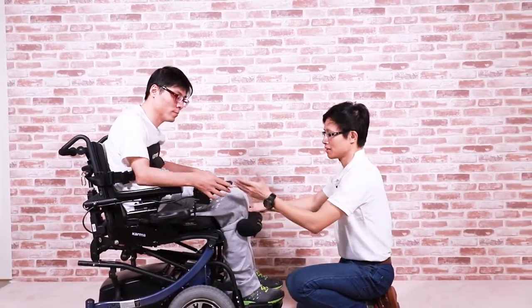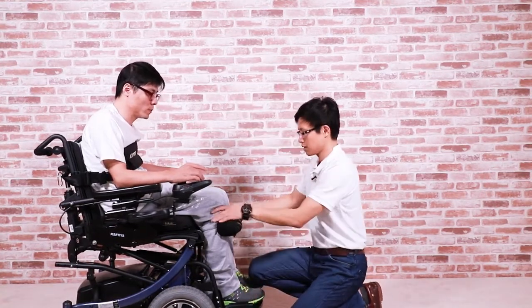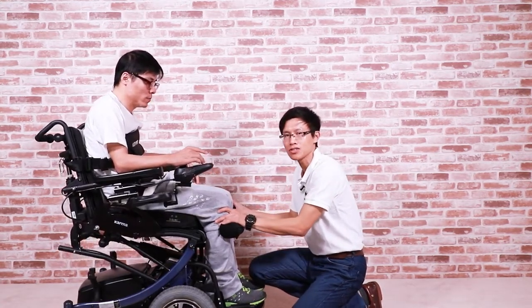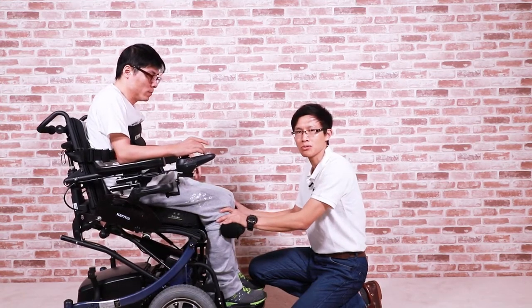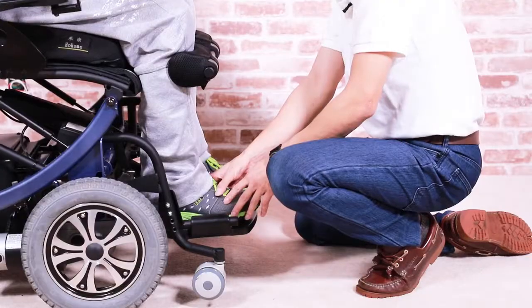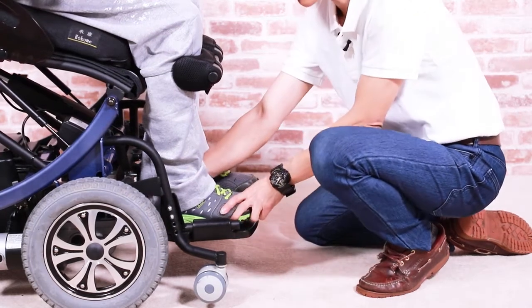Finally, let the user control the controller while standing up, because he knows best about his body. When he is uncomfortable, he can stop or slow down the process right away. Remember to ask the user to stand up as slowly as possible, since a rapid change of body position might trigger contraction or tension. If his legs are misplaced during the stand, we can help him to position his leg again.